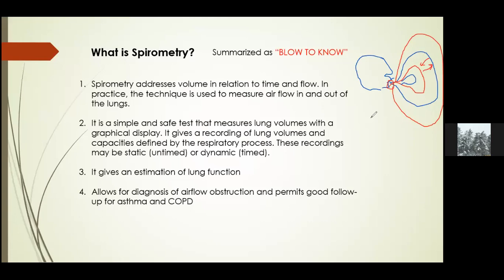And then when you are given instructions to inhale, the same spirometer will measure how much volume you have taken in. So spirometry, as we say, it is a very simple and safe test to measure the lung volumes, and they are represented in a graphical display. That means whatever we'll get, we are going to capture it in form of a graph.